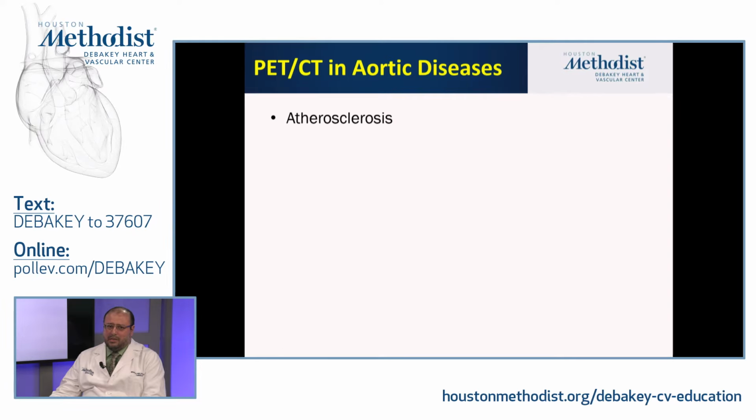The first one is imaging atherosclerosis, and this is where it probably all starts. We use tracers that will image inflammation. Now the theory of atherosclerosis is that there is an inflammatory process happening there.